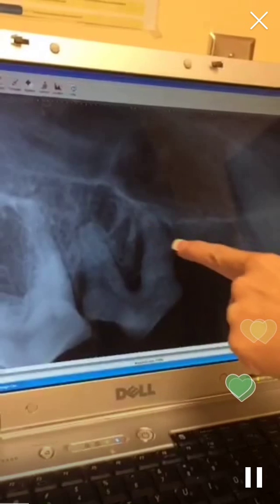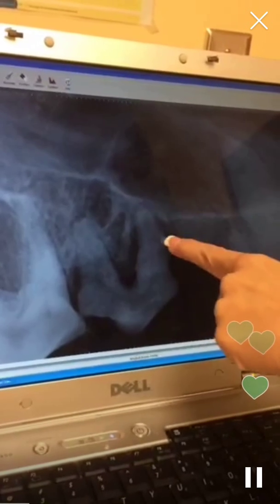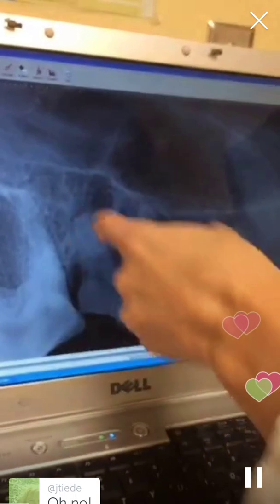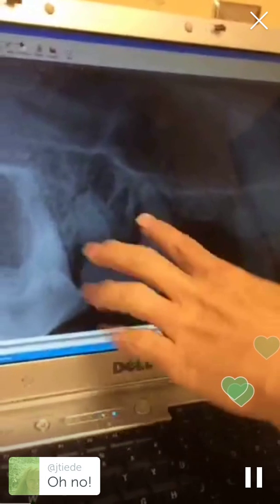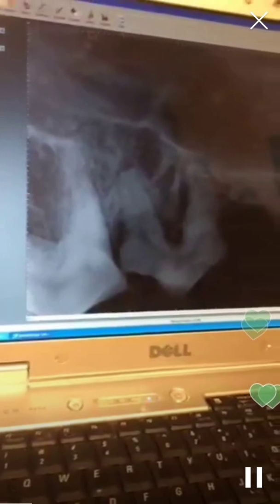And now we have what's called periapical abscessation, where the periodontal ligament becomes wide here and bacteria just goes right up in there and eats away. So we did extract this tooth. This 4th premolar also is extracted, and I'll show you a picture of what that looks like.